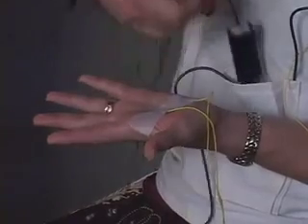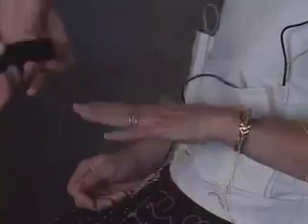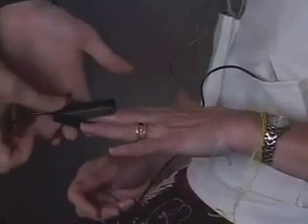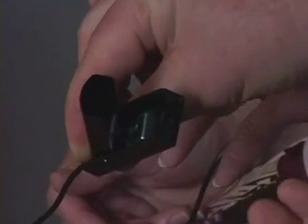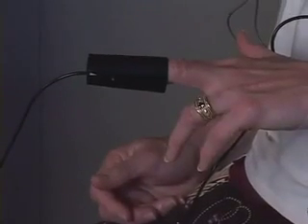And the plethysmograph goes on next. And if Kate, you can rotate your hand, please. I guess it would be helpful, if I may. I'll just show that the sensor here for the plethysmograph is right here, and it should go on the fat, fleshy part of the finger. And it just slips over and gently, snugly connects.